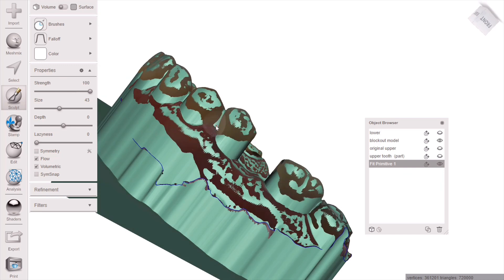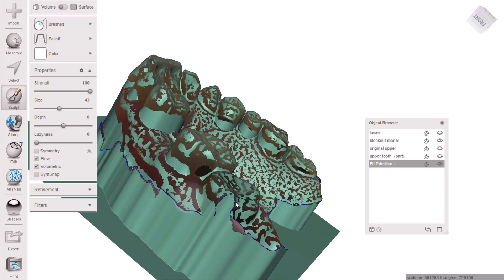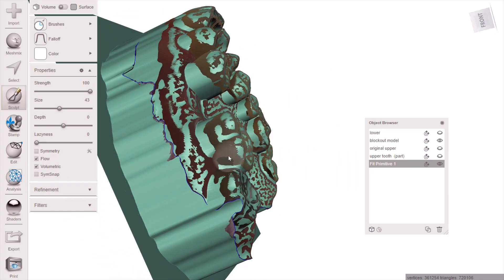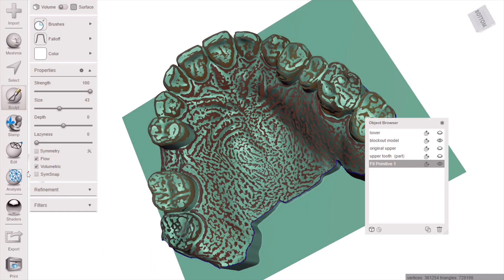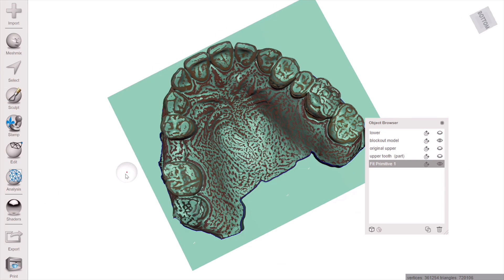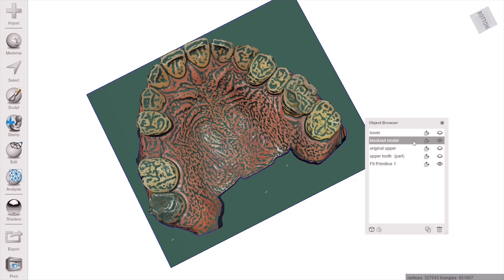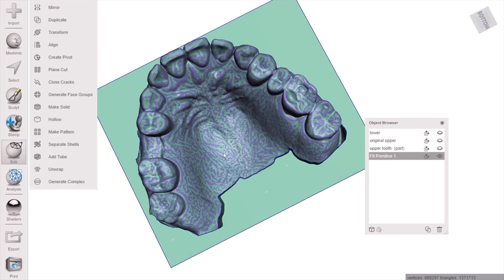The next step is to modify the block out model in order to engage undercuts of your clasp. Just remove a little bit of material right at the tip of your clasp engagement by using robust smooth or bubble smooth and smoothing it down.